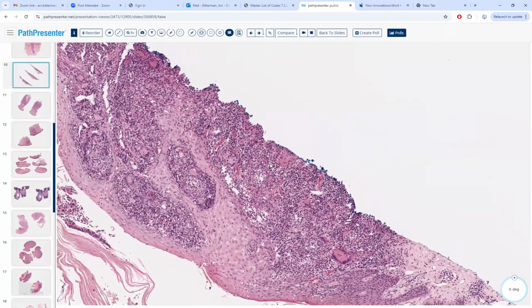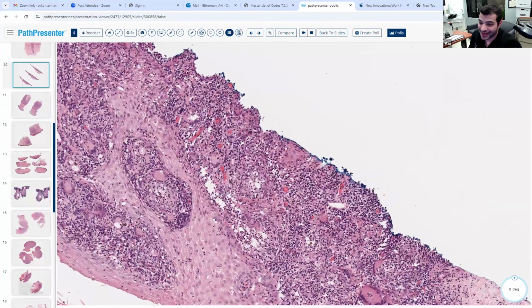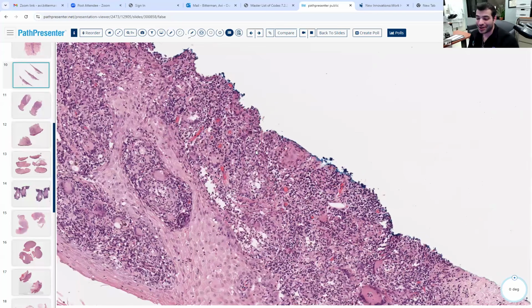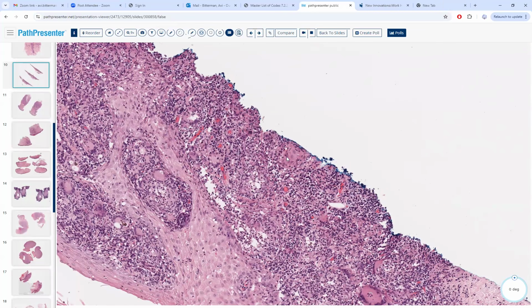Maybe infection. It's a very good sign of infection. But what do we call the type of inflammation? Suppurative? I'm sorry, it was really low. I couldn't hear it. Suppurative, because suppurative is the neutrophil part, right? And granulomatous. Yes, a suppurative and granulomatous dermatitis. Right, you're absolutely right. You have to think of infection when you see this.